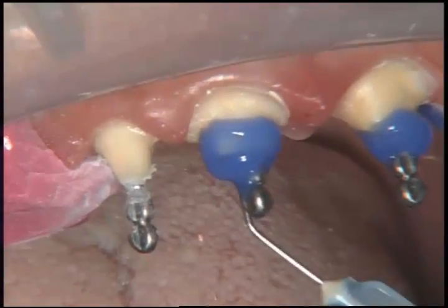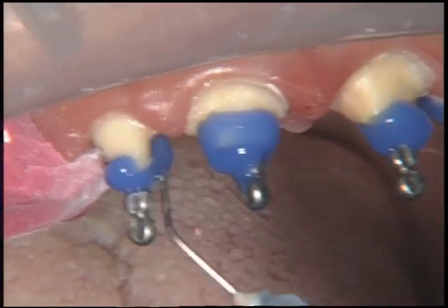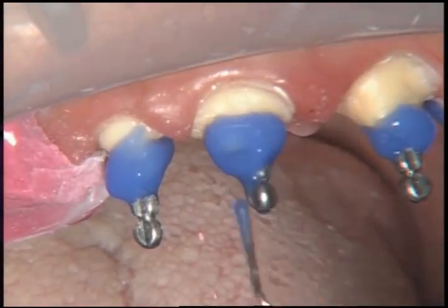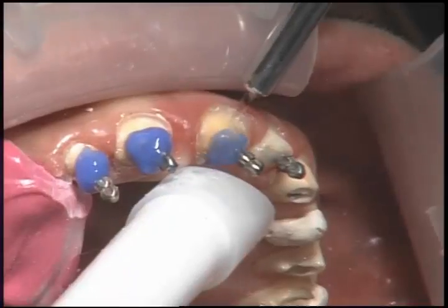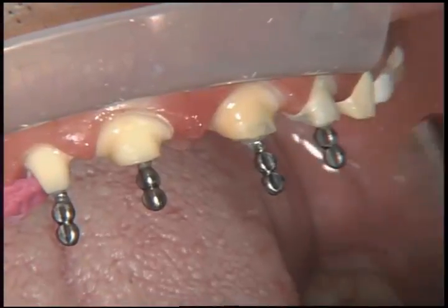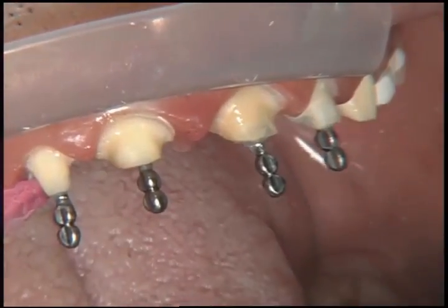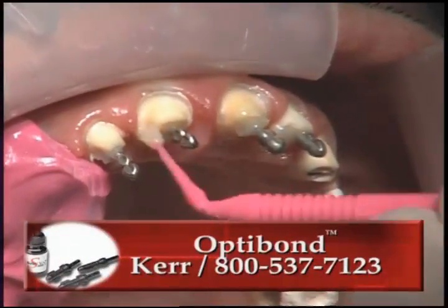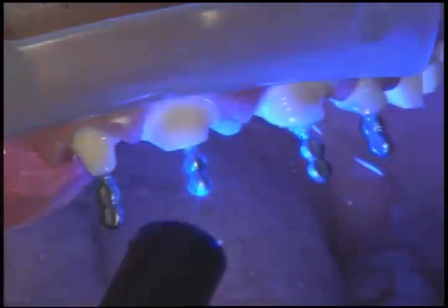The Uni-M has been light-cured and is also chemically cured at this point, so we don't have to wait too long, and we're ready to go ahead and etch the tooth. We etch a little bit of the post at the same time, just to make sure we got the entire coronal portion of the tooth. Because we're etching dentin at this point, it stays in place for 10 seconds and then we rinse it off. We remove the excess moisture, still leaving it a little moist for the bonding agent. This is Optibond from Kerr — we'll go ahead and paint this on everywhere, including on the post, and then light-cure that into place.